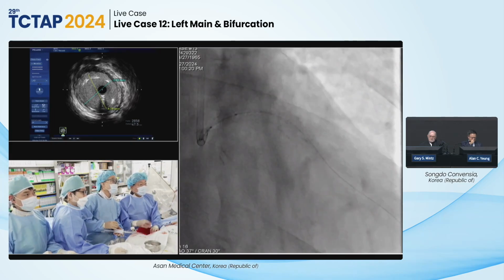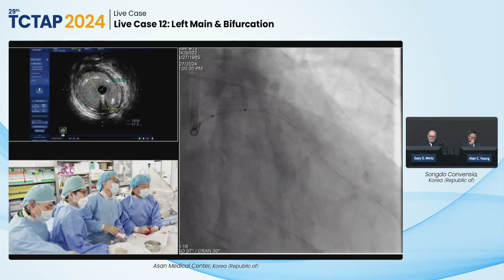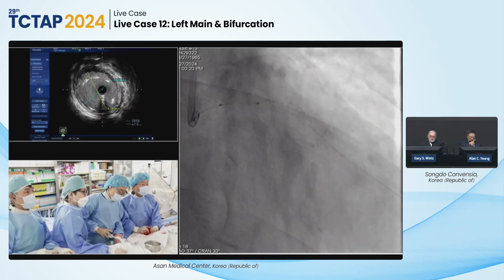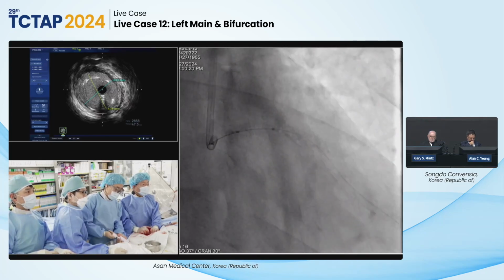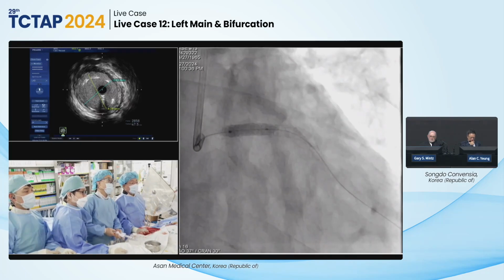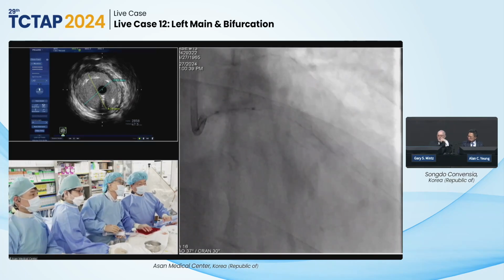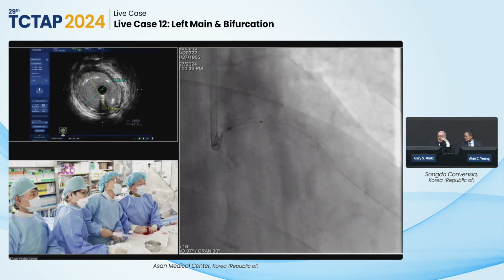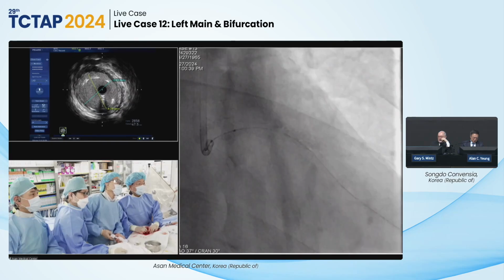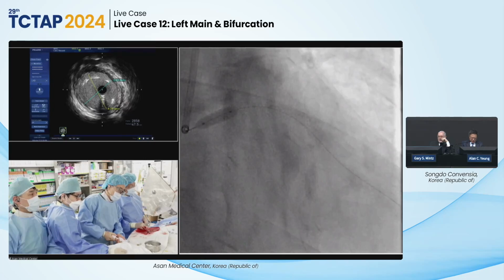And then we're going to do a little bit further. I want to make another inflate just a minute. Okay, here we are. Another inflate. Inflate. One more. 20. Very enough. Okay, deflate. Yeah, I think it's important to make sure that you inflate it into the aorta, so you pick up the very proximal edge of the stent. Yes. Yeah, you can really see it that well. 24. So that's probably good.